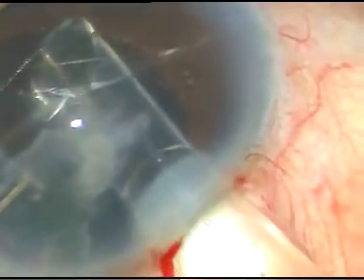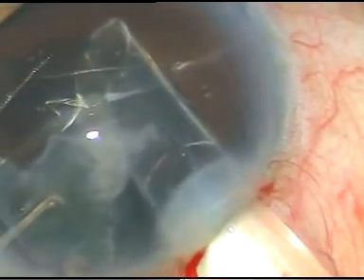And here it is. This is a B cartridge from Alcon, and the lens is sensor multi-piece lens. In B cartridge I can use only one hand to inject it, and my left hand is free if it is required.